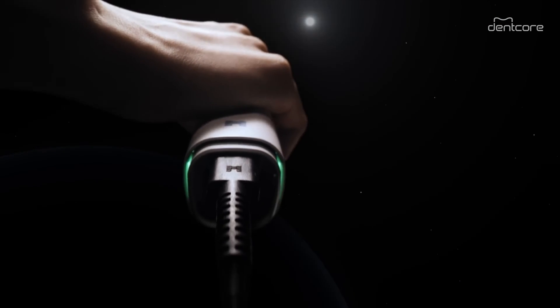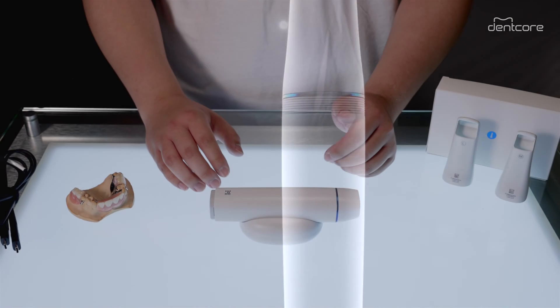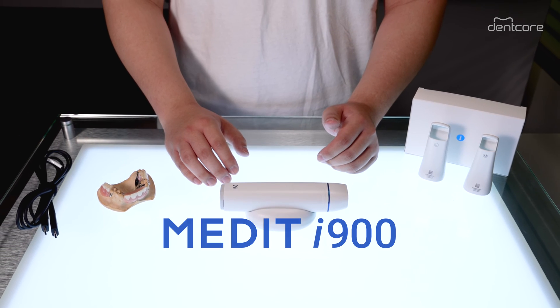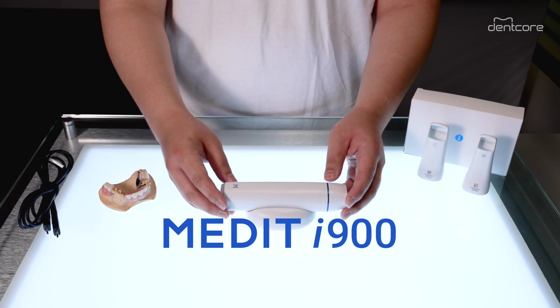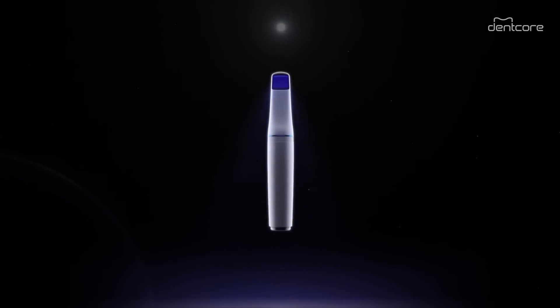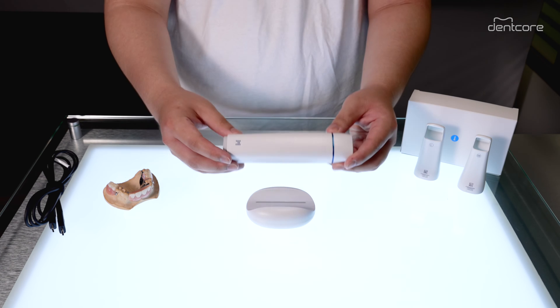Hello, Jun here from Dencore and I'm super excited to introduce to you the latest and flagship scanner for Medit, the Medit i900, a leap forward in intraoral scanning technology. So let's go over a few notable hardware features of the new i900 scanner.